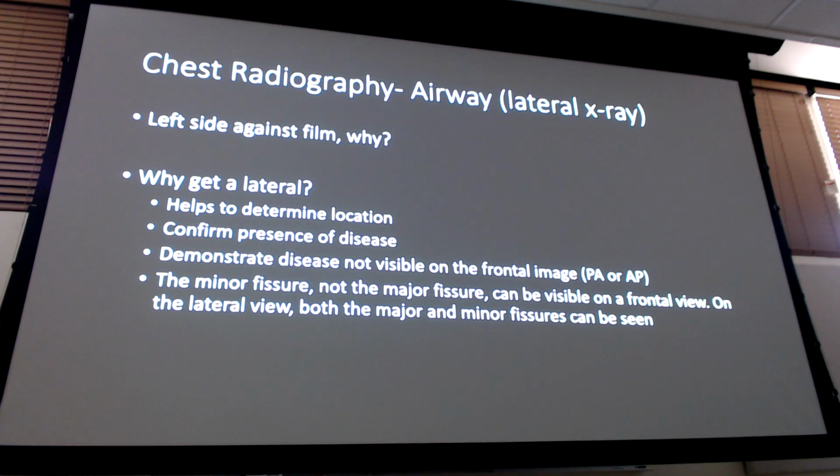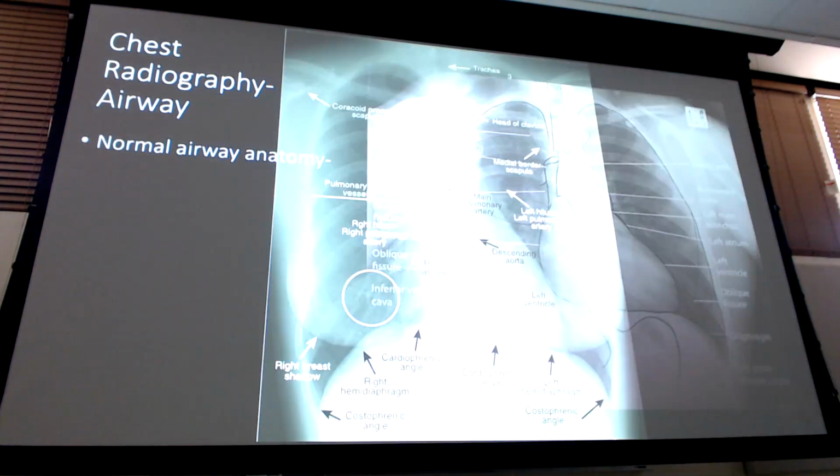Guys, don't give yourselves headaches looking at the fissures. When we get to the abnormalities, you'll see that fissure stand out. Like when there's fluid in a fissure, you'll be like, oh, well that makes sense, once I show it to you. So for right now, don't get hung up trying to find the fissures.